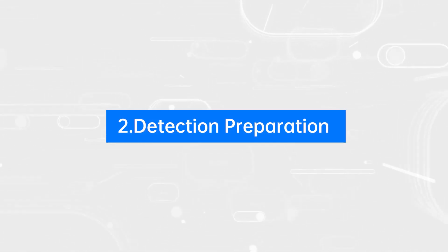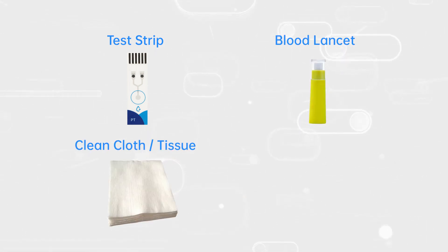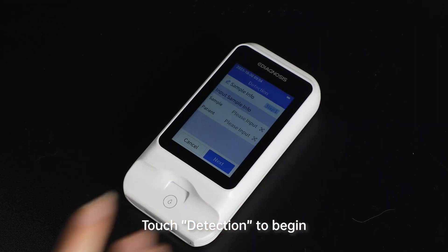Step 2: Detection Preparation. Gather the required items: a test strip, a blood lancet, a clean cloth, a tissue, and an alcohol pad. Touch Detection to begin.